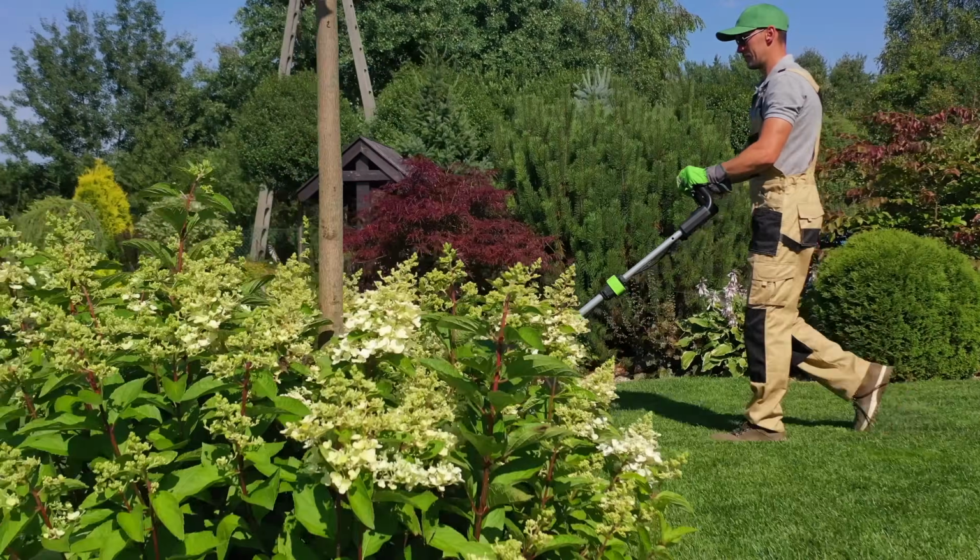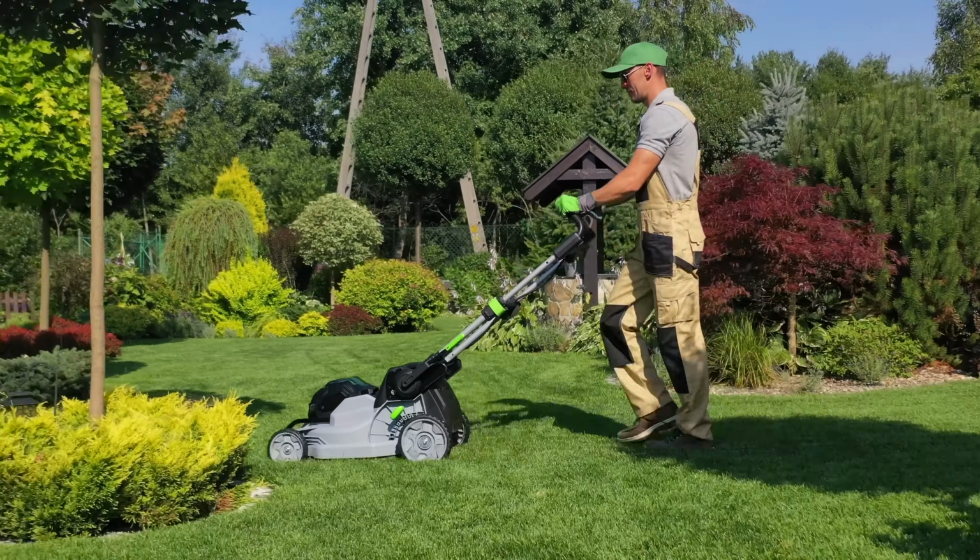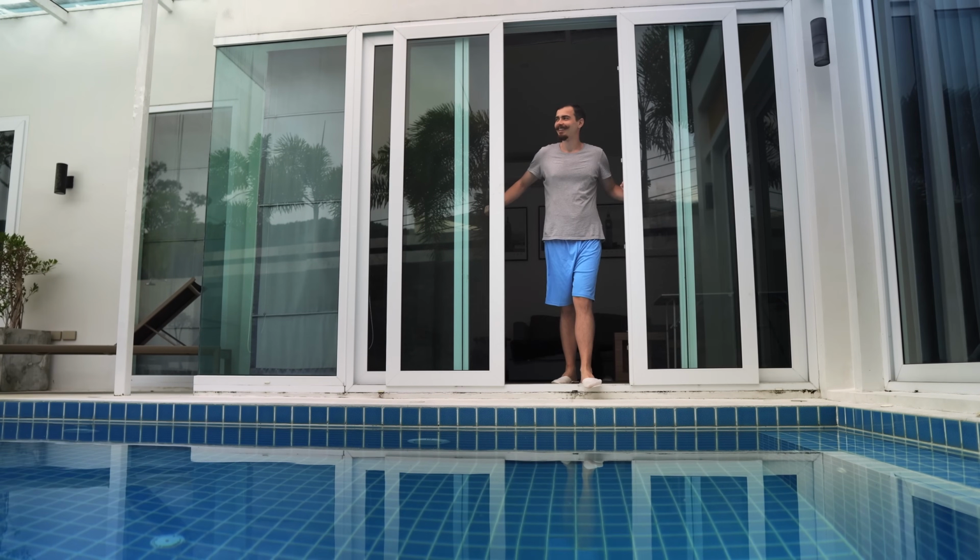But imagine halfway through the day, you decide to go outside to do some yard work or to take out the trash. If you leave your phone behind, there's a really strong chance that you've gone beyond that 30-foot transmission range and your hearing aids have now become disconnected from your phone. While you might come back into the house and return to the very same room that you were in before, you may find that your hearing aids and your phone just still don't have an active connection. And because your hearing aids are likely beyond that 1 to 2 minute pairing mode that happens right after startup, your hearing aids may seem disconnected from your phone for good.